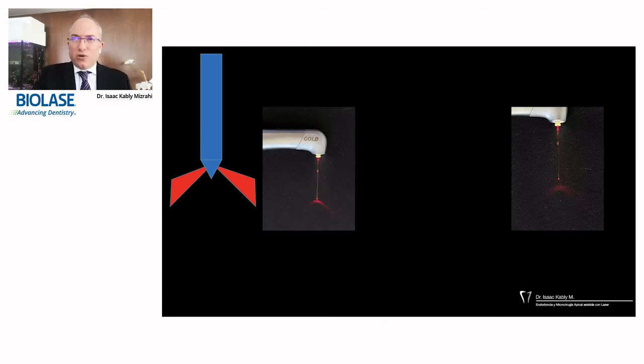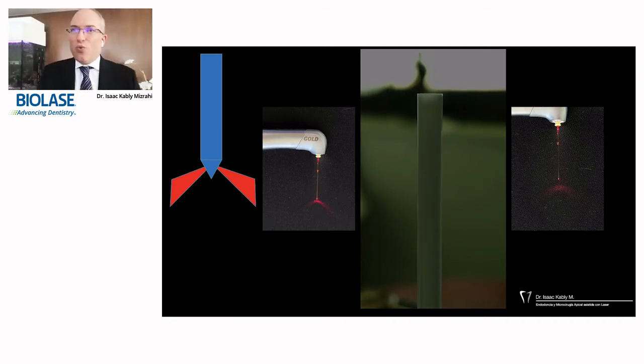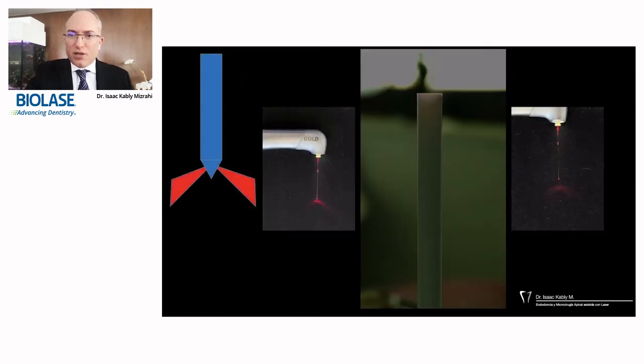Now look at the videos. Look at the video here. And when the RFT goes inside the plastic tube, the light is not projected apically.